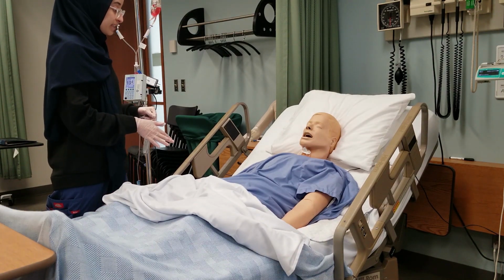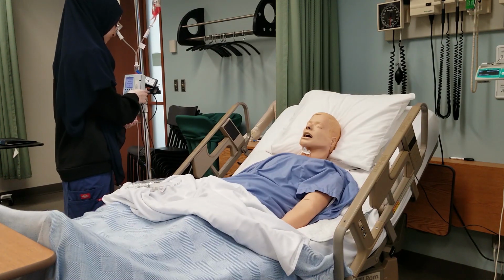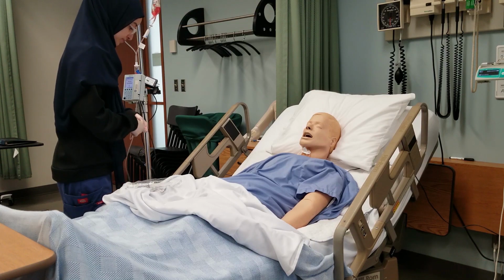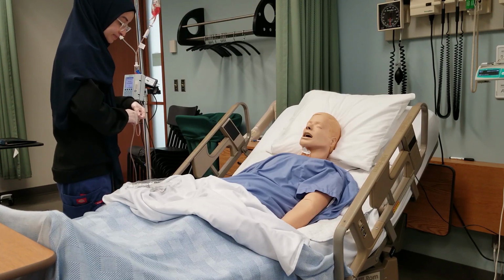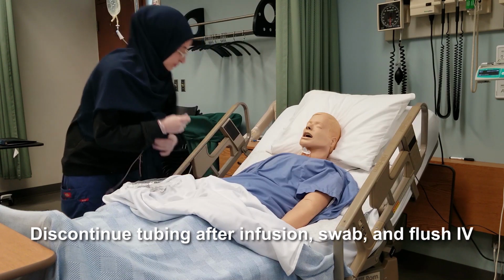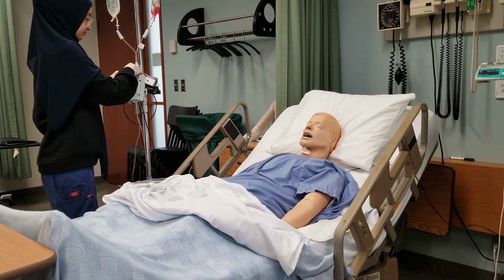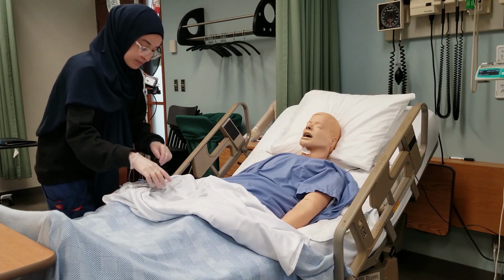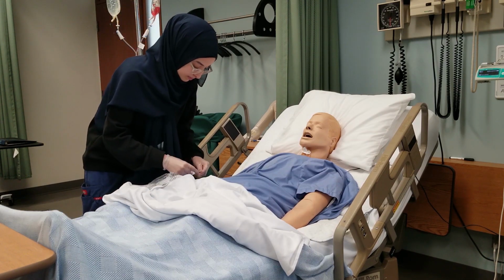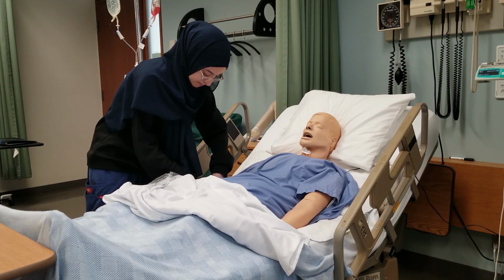I'm just going to go ahead and disconnect you and flush your line, okay? Just swabbing it off.